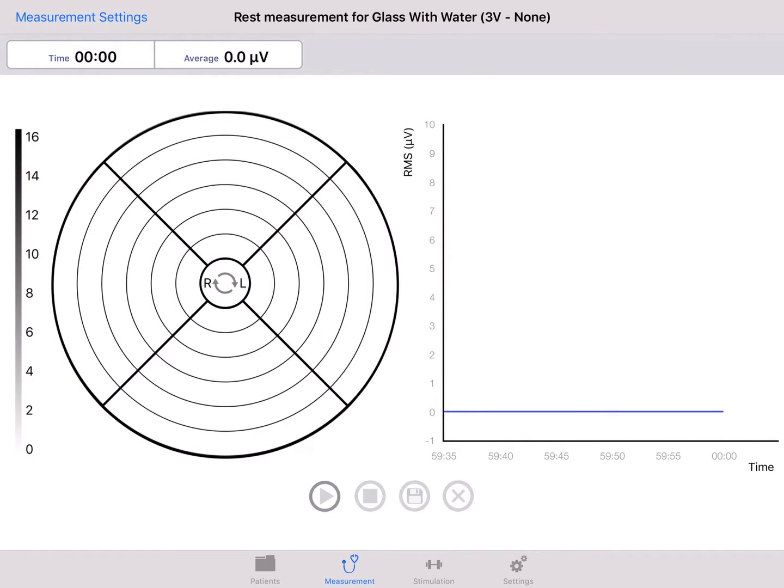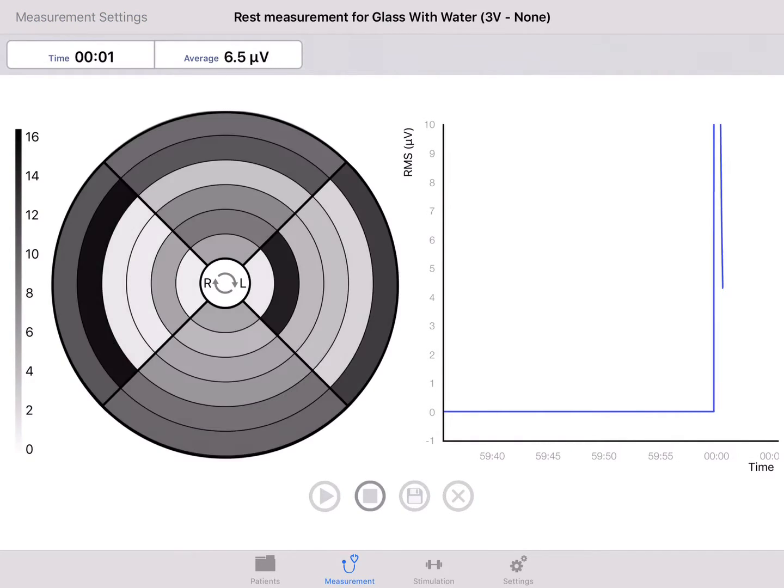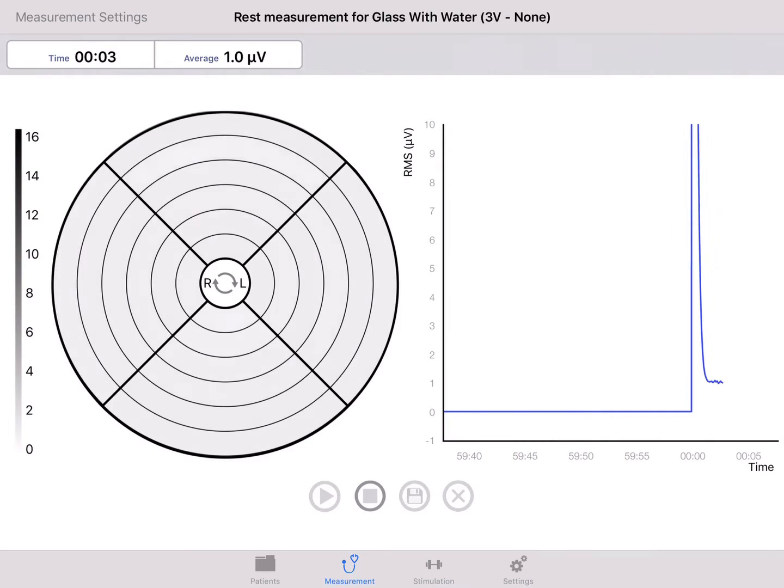When pressing the play button, the measurement will start. At the start of every measurement, the system checks whether all electrodes are in proper contact with the patient.